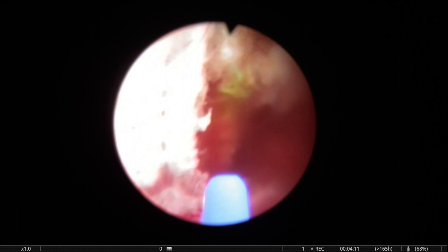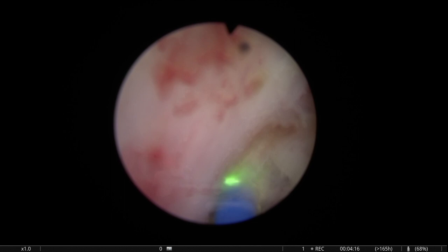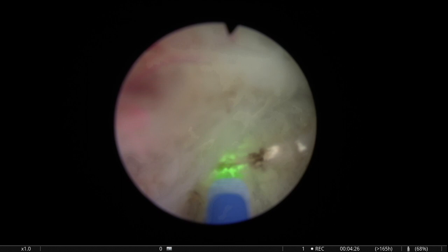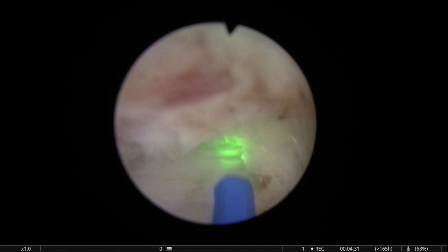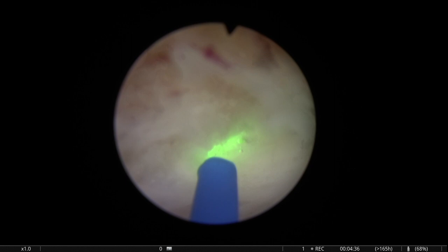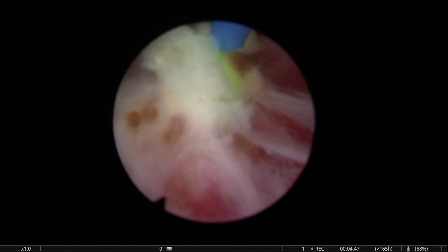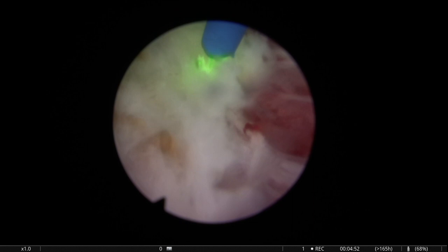I think it's an interesting case because you see there are some apical nodules, and the differentiation of the plane is not easy. So all through the operation, we're going to be testing if the plane is correct, if the depth is correct, and there are many small adenomatous nodules that are growing into the capsule and make the dissection a little bit of a challenge. The prostate endoscopically looked small, but it was actually quite big. I think it was about 100 grams of tissue that we took out at the end.